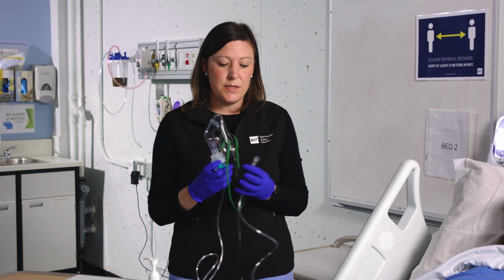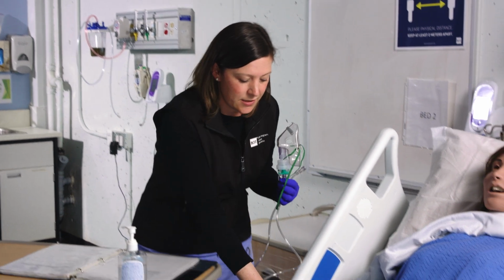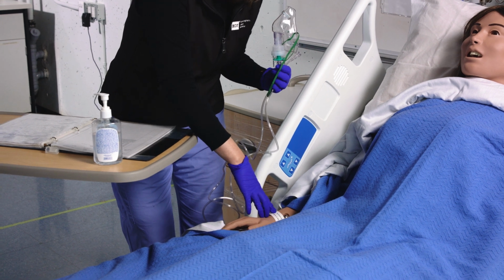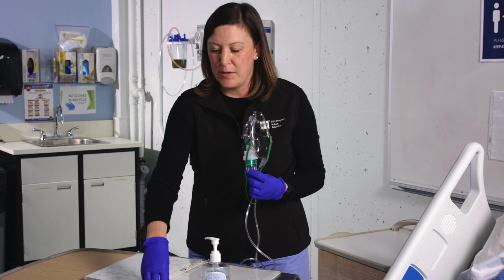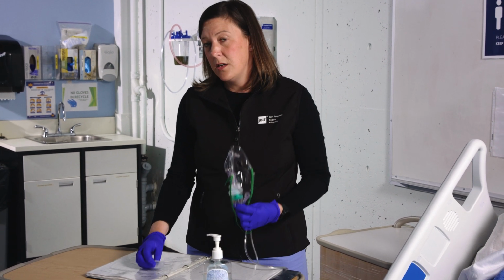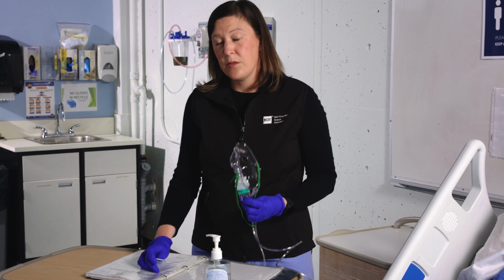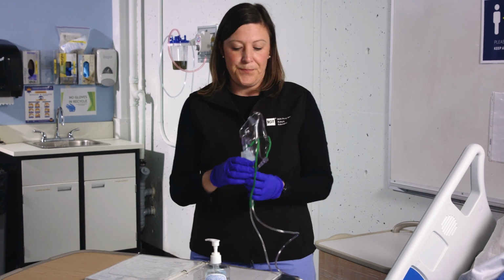But before I do so, I need to make sure I complete my third and final check. This includes looking at her name band, having her verbalize her name if possible, checking her date of birth and MRN, and I'm going to check it to the MAR here. I'm also going to do my third check of the medication, that I'm giving the right drug, the right dose, the right route, it's at the right time for the right reason, and I'm going to document after I've put it on to Mrs. Jones.